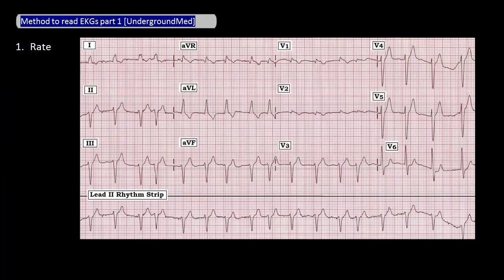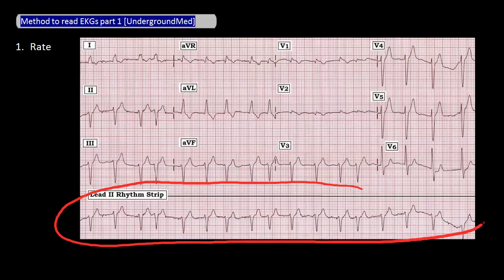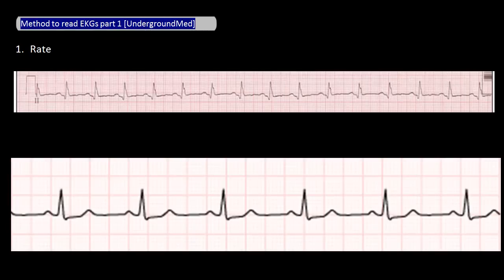First is rate. To measure the rate, look at the so-called rhythm strip, which is usually at the bottom of the EKG. Count the number of QRS complexes all the way across, and because this represents 10 seconds, multiply that number by 6 to get the rate for 60 seconds.